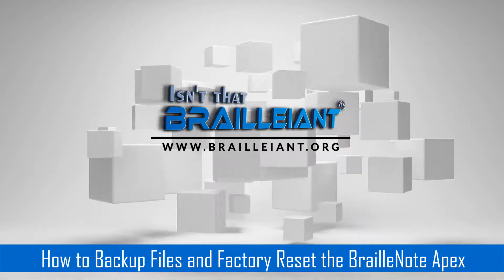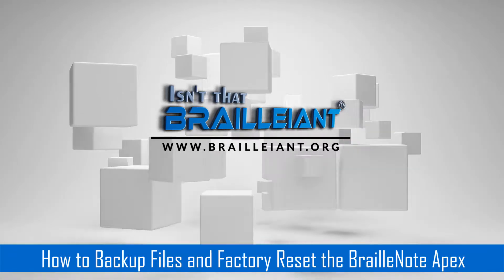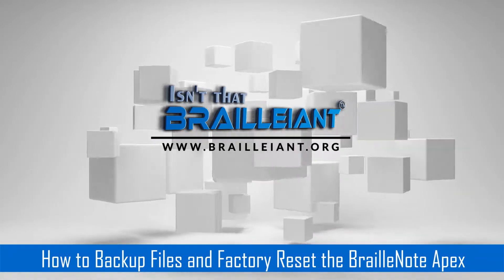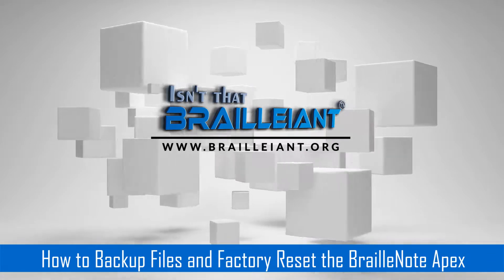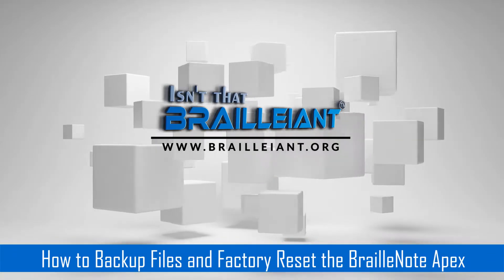Those were the administrator files that have control of the KeySoft operating system. Do not replace these if you have or are getting the BrailleNote Touch. If you're going to get another BrailleNote or an older BrailleNote, press Y when prompted to replace. These will save your settings, and when you restore these files, your BrailleNote will place them in the proper folders and your settings will be stored.